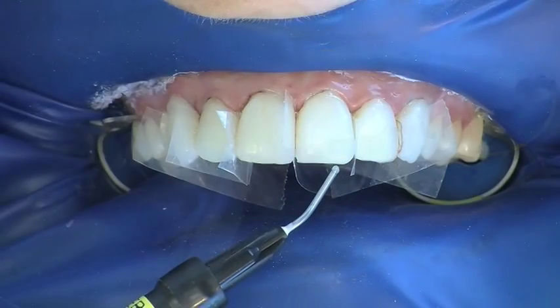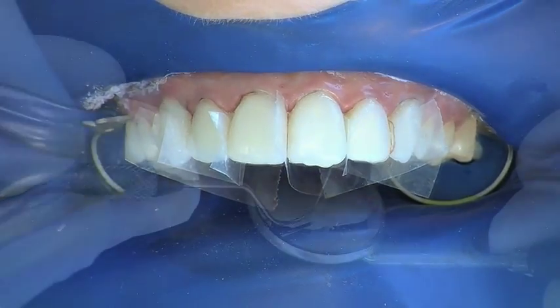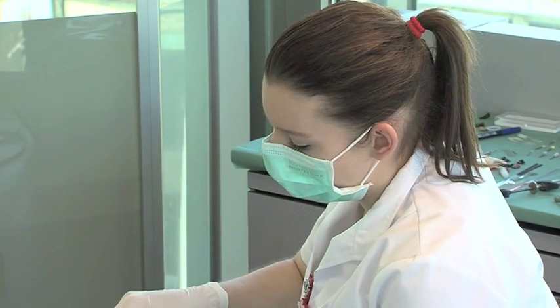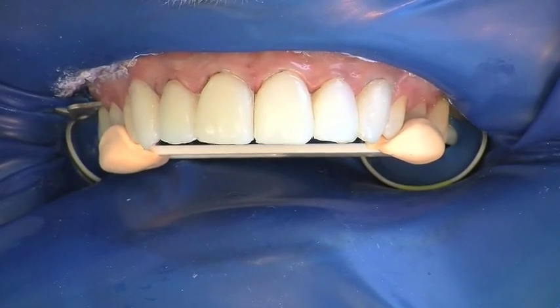Further Componeers follow in the same fashion. The marginal areas can be sealed with a flowable composite to ensure marginal integrity. The tooth axes and tooth lengths are checked before finishing.